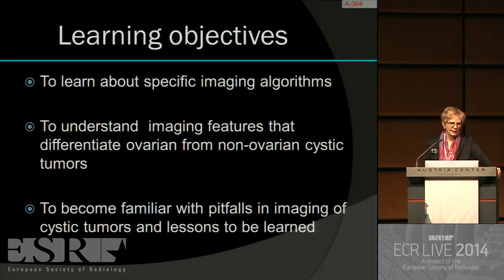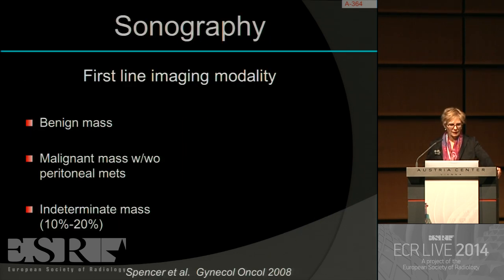So the learning objectives in this session are to learn about a specific imaging algorithm, to understand imaging features that differentiate ovarian from non-ovarian cystic tumors, and to become familiar with pitfalls in imaging of these tumors.